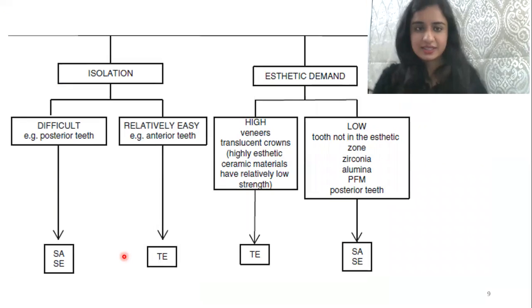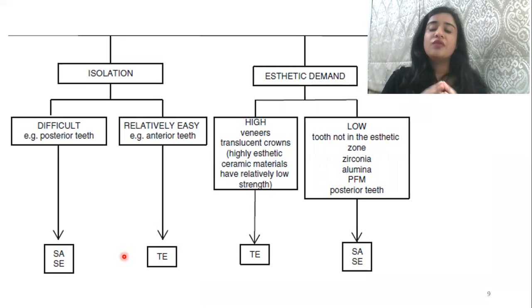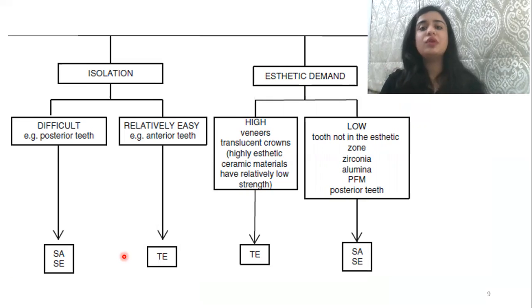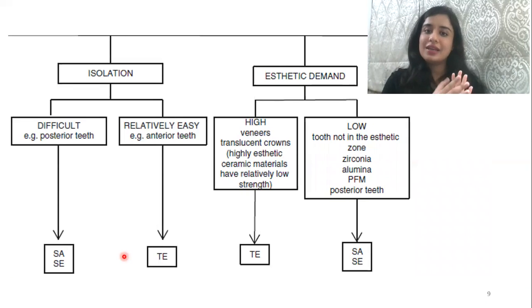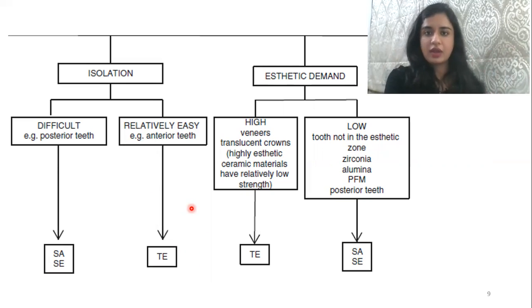Okay. So let's make it easy. Again, when we need isolation. So supposedly we have posterior teeth. Okay. So we want to bond somewhere in 3-6 or 4-6 or somewhere in the upper posteriors. If it is going to be difficult, it is very tough for you to use a total etch system over there because it is going to involve multiple steps. So let us take an easier option and go for a self-adhesive or a self-etch resin cement. And if it is relatively easy, then you can go for a total etch. That is your anterior teeth. So here we know when isolation is required, which kind of resin cement we have to use.